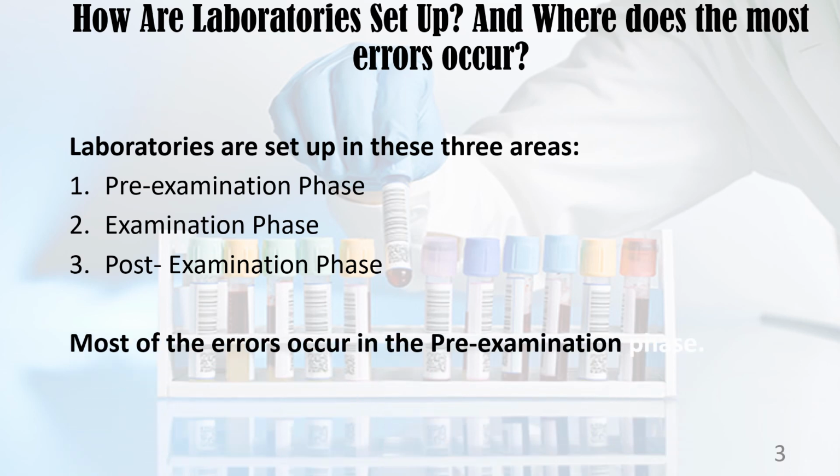It happens to be that almost all the pre-analytical examination problems that we have with test results occur at phase number 1, at the pre-analytical or the pre-examination phase. Resulta ser que todos los errores de sangre que hemos hablado, ese porcentaje, ocurren específicamente en el área de preexaminación o el área preanalítica, que es en donde se saca la sangre.